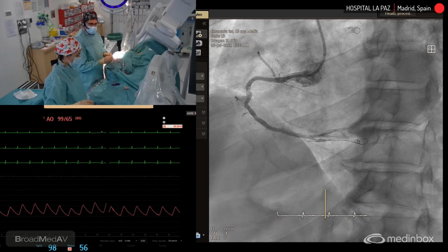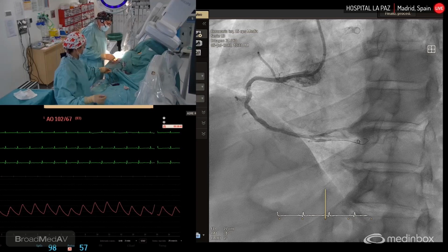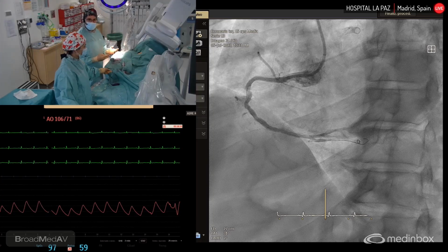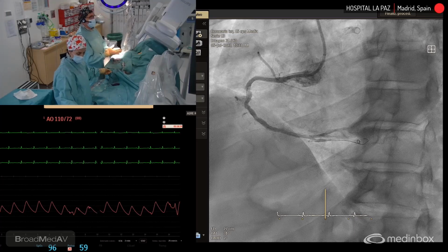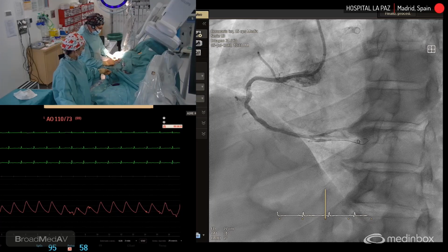As I said before, you can see with imaging techniques no large fractures, no big ruptures of the calcification, but laser in some way modifies the response to dilation that makes the plaque easier to dilate, and we have seen good expansion after laser in severely calcified lesions.